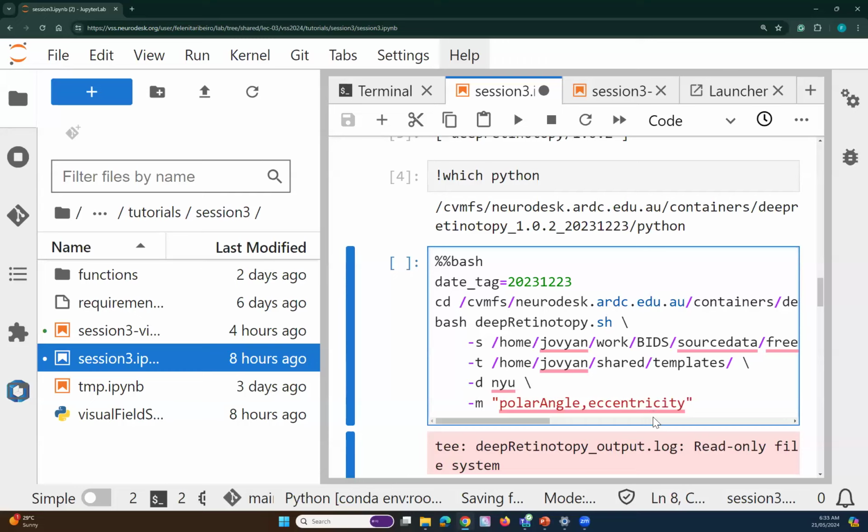So as part of the pipeline, we generate the mid-thickness surface using FreeSurfer, and then calculate the curvature of the surface and resample that curvature maps to the HCP template space. That step, the generation of the mid-thickness surface, takes about 15 minutes.